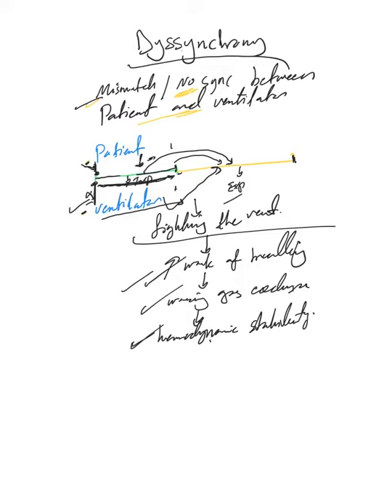And remember, this desynchronization problem or mismatch or fighting happens only if the patient is still able to trigger a breath.